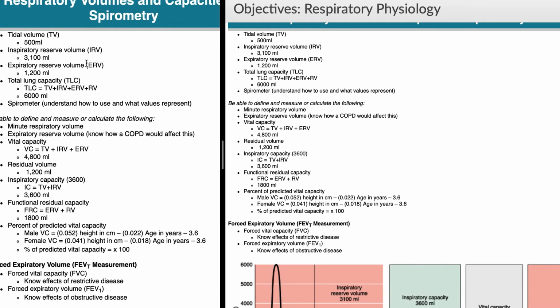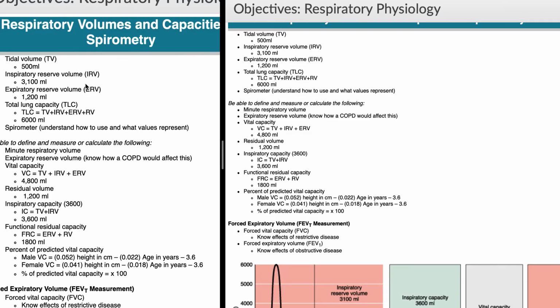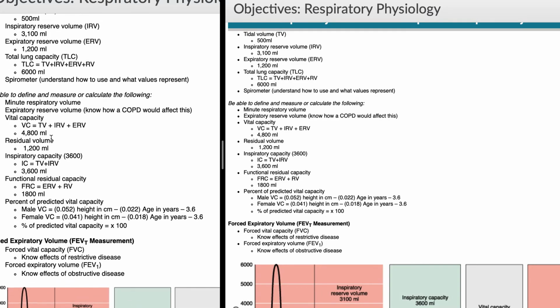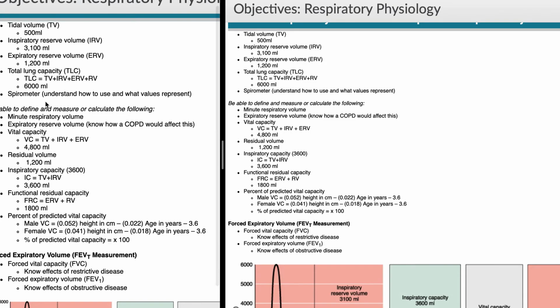These abbreviations can just be nice. It makes it more efficient to be able to think about them in your own head or write them out by hand. But it's important when you're first learning something like this to make sure you're saying the whole word because these words are really useful. They tell you a good majority of what it means. So they sort of are self-defining terms, which is nice. The last term is spirometry, or spirometer, which is an instrument used to measure these volumes. And so, really, you could think of this topic as spirometry, the measurement of volumes for breathing.